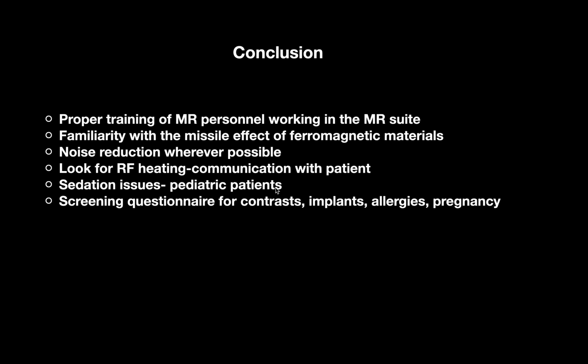Sedation issues, like in the pediatric age group, we can solve by the use of sedation given by the pediatrician or anesthesia, and we should always know about the emergencies in the MRI. Screening questionnaires should be there for contrast, implants, allergies, and pregnancy. So this is the conclusion and this is the take home message for today's session.